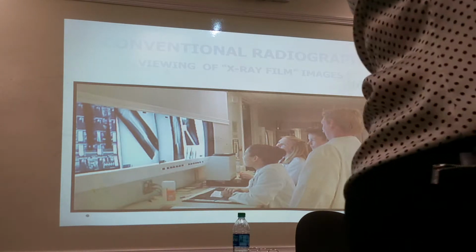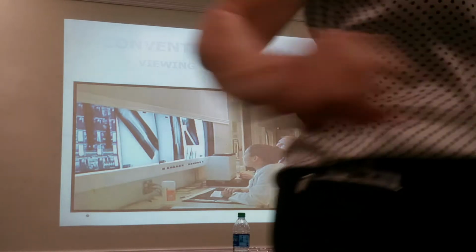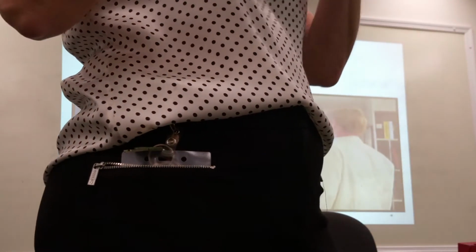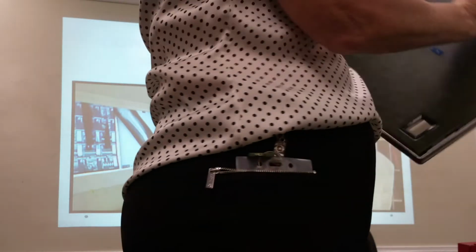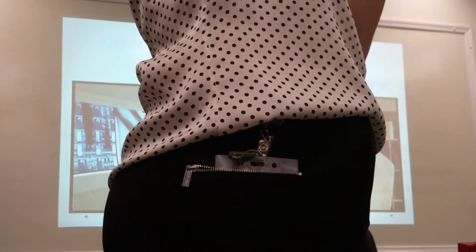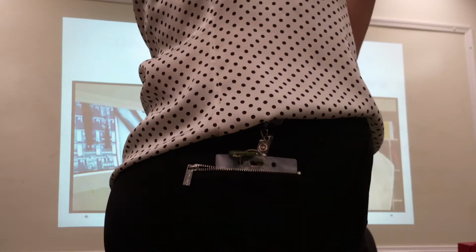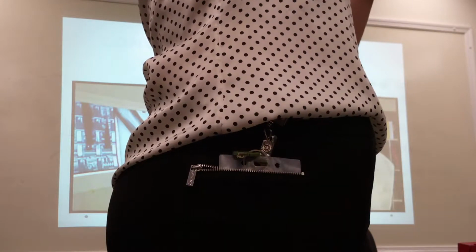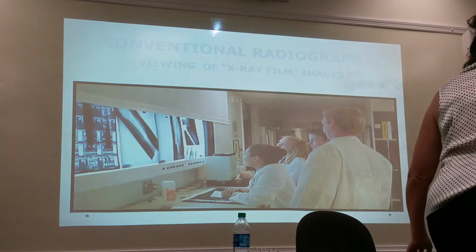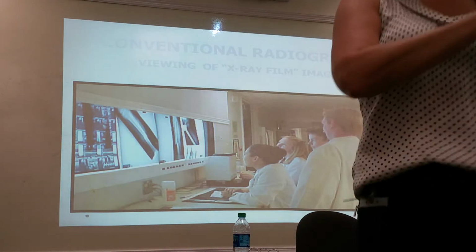See this? So what happens, can I borrow your pencil? Sure. What happens is either you put the patient's name on a card, put it in the reader, put this in there, it opens up this little window and exposes it with a light bulb actually. It flashes light and the patient's name is now exposed on that corner. It closes this up, you take it out and go to the darkroom and process it. I would show you that, but I threw them all away.